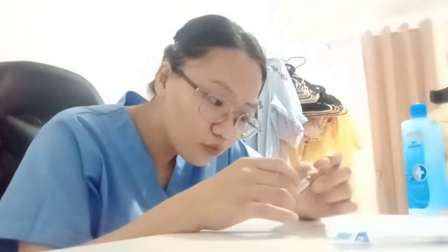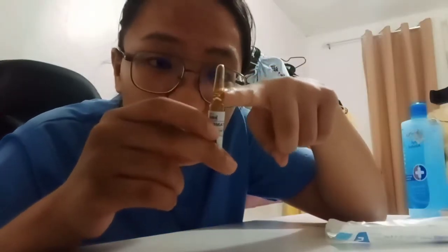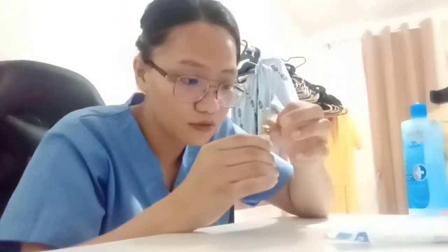Next is to prepare the ampule for drug withdrawal. First, flick the tip or top of the ampule so that the medication will go down to the bottom.